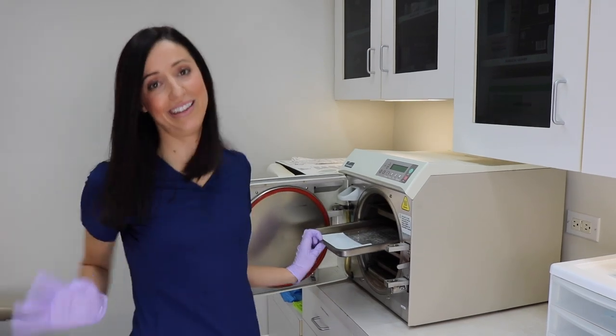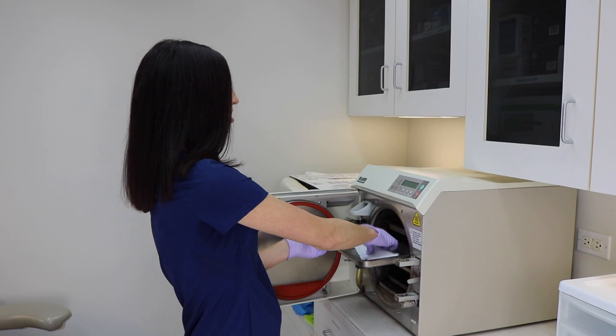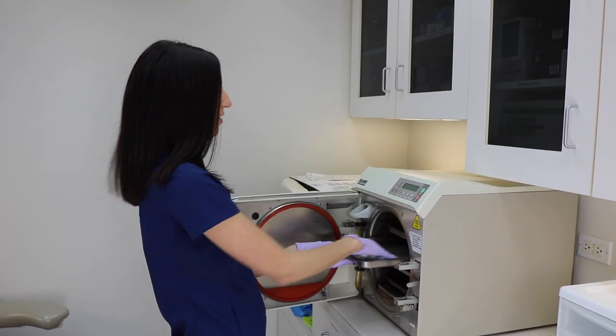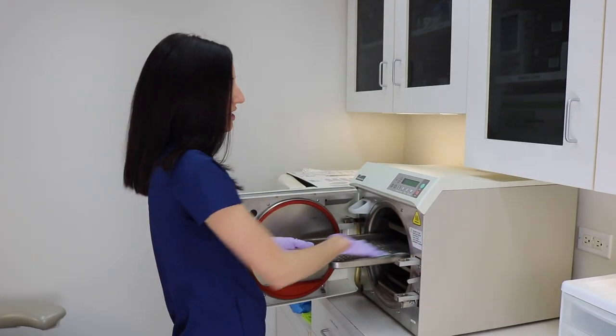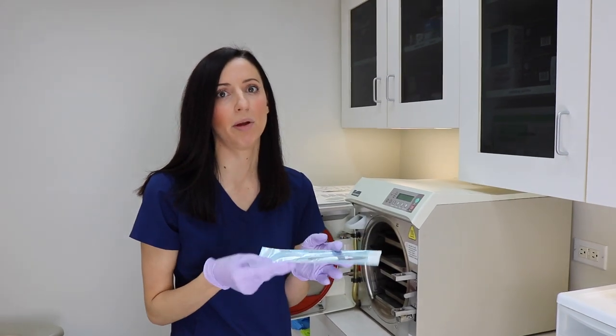Now we load the autoclave. One fun fact: you should never stack pouches on top of each other — give them their own space so the steam can air out properly. I have a separate video about whether pouches should go paper-up or paper-down — I'll link that below.